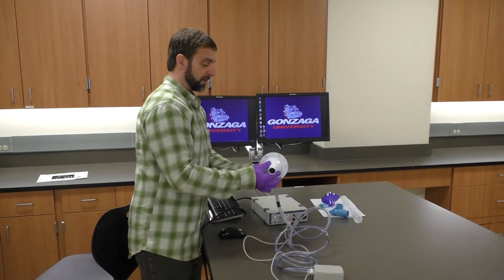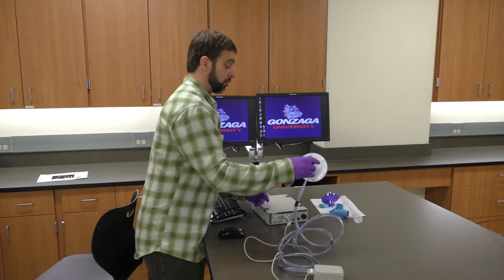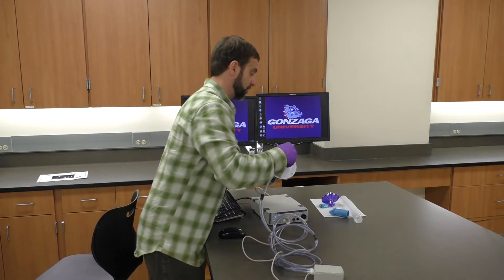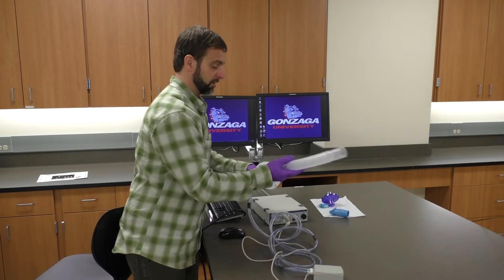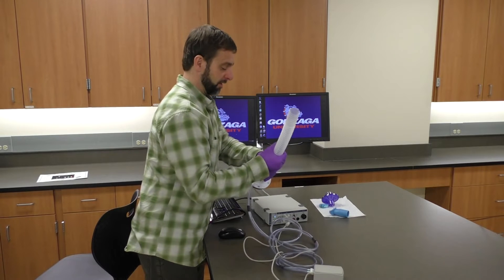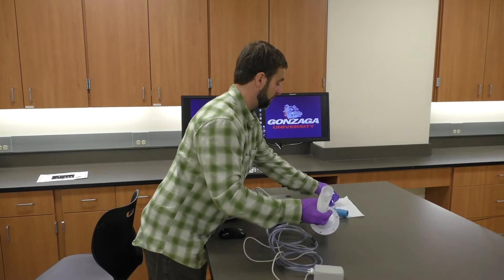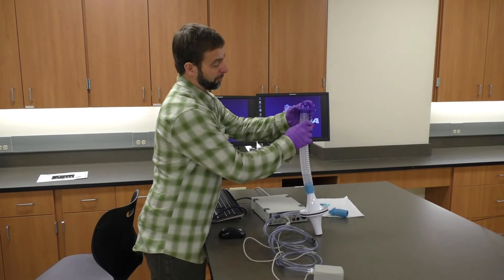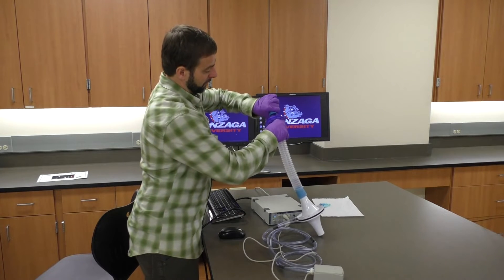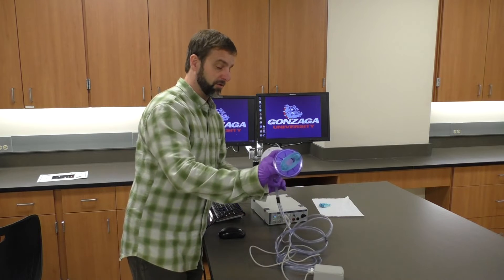This is a pneumotech or flow head, and it's a reusable device. We use a filter so that nothing unwanted gets in there. Going out to our subject, we need a nice disinfected system for them to breathe through. The adapter goes onto the flow head like this — it doesn't matter which side initially, as we can make adjustments in the software. One side of the purple filter fits snugly, and then finally you put the mouthpiece in right here.